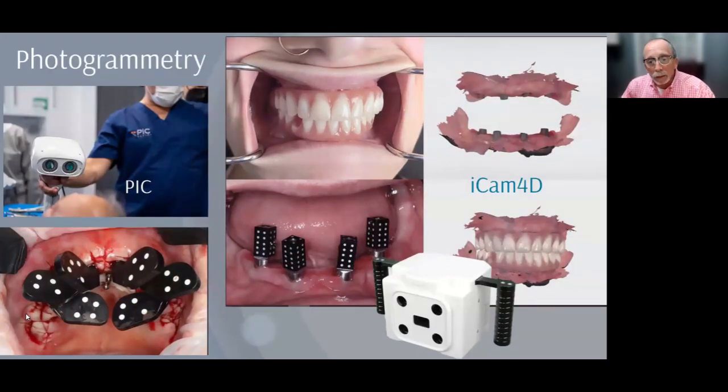In our implant topic, this has got to be, if not the leading, one of the leading areas where we've seen a lot of growth and conversation. We have all this technology with various systems where you can buy this super sophisticated camera and the scan posts that go with it. You can put these posts in, capture with this camera, and that data can be transferred over to our design software or our planning software. And the result is a super accurate transfer of data.